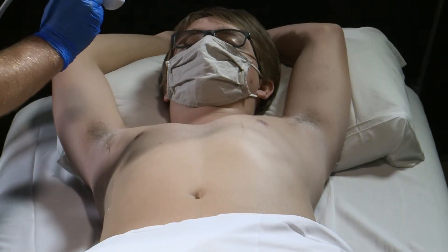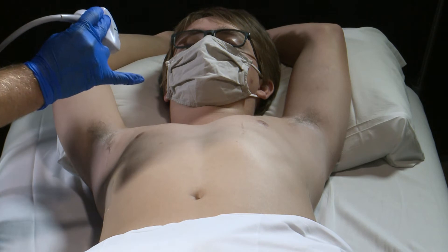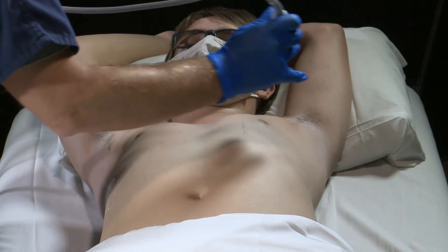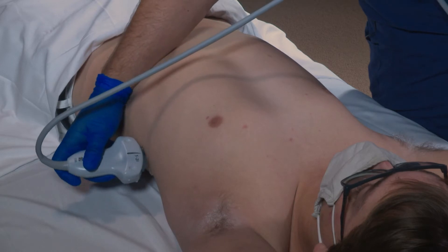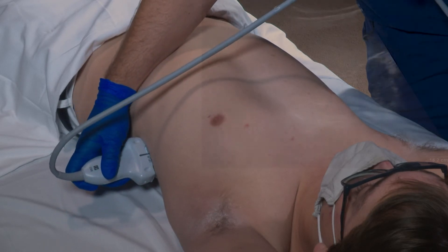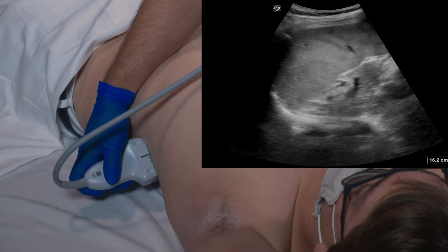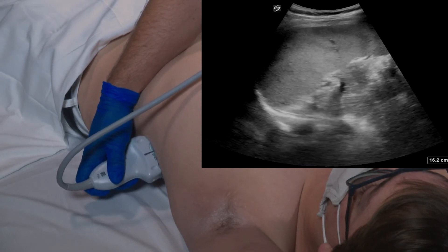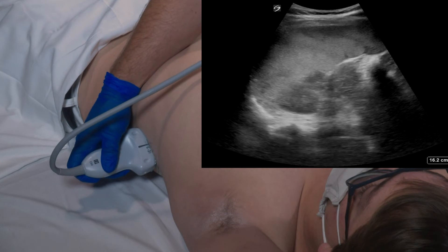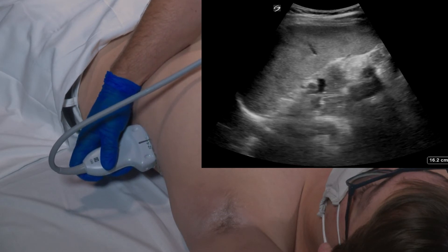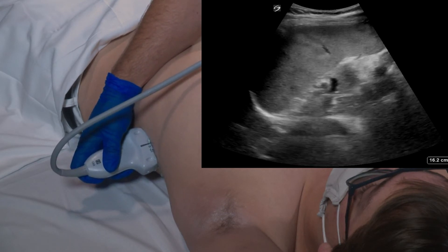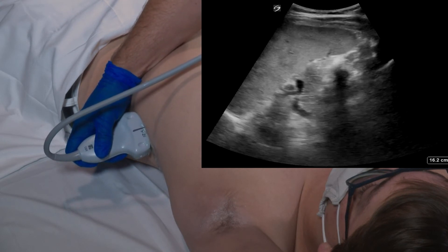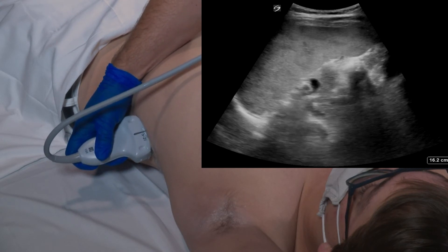The left upper quadrant image is obtained by drawing an imaginary line from the xiphoid process all the way over to the posterior axillary line. As we place the transducer in this area, we're going to be looking for any fluid that may collect around the spleen. We're going to look at the superior pole of the spleen and aim down so that we can also see the inferior pole of the spleen as well.